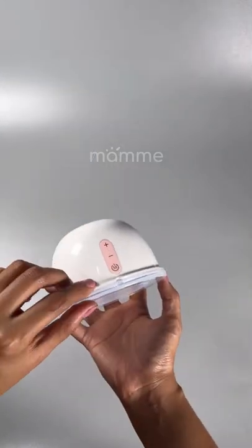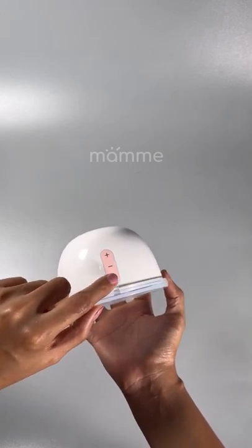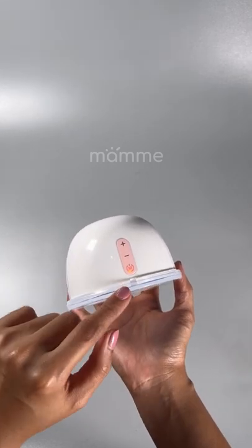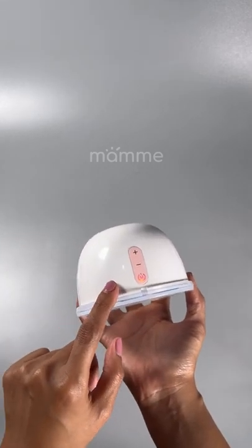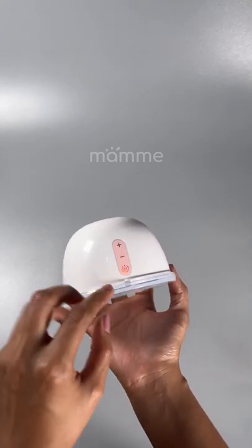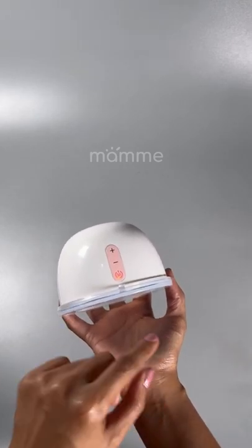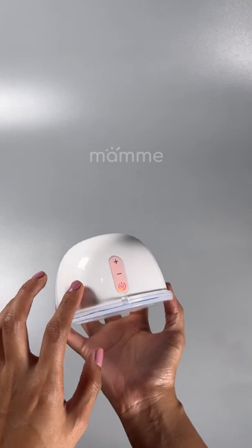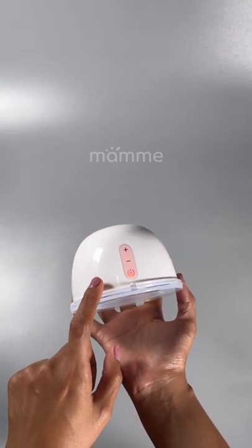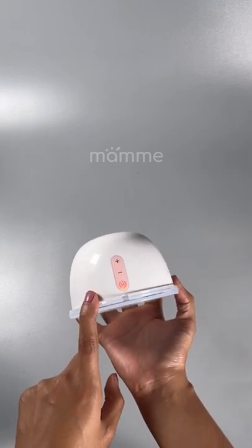So, open the pump. How do we do this? Let us press the power button until makakita ka ng color dito. Ayan, mararamdaman mo din siya mag-open. Ayan, color green, then nag-red. So, yung color green na yon that you see before, the red color, that is the battery indicator. Ang green, ibig sabihin, 31% to 100% ang battery life. And it changes over time. Mag-orange siya kung less than 30% na lang. Red kung less than 4% na lang. Kapag nag-blink, ang ibig sabihin, you will really need to charge the battery already.